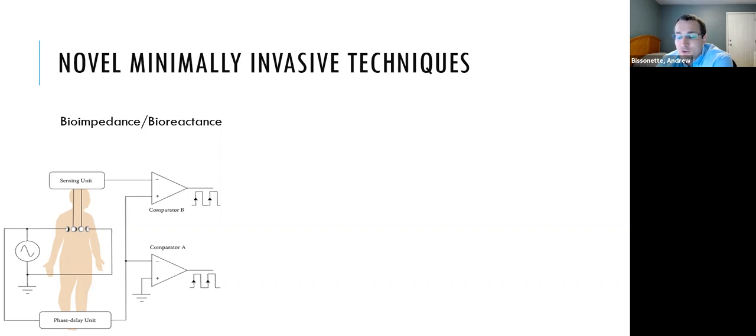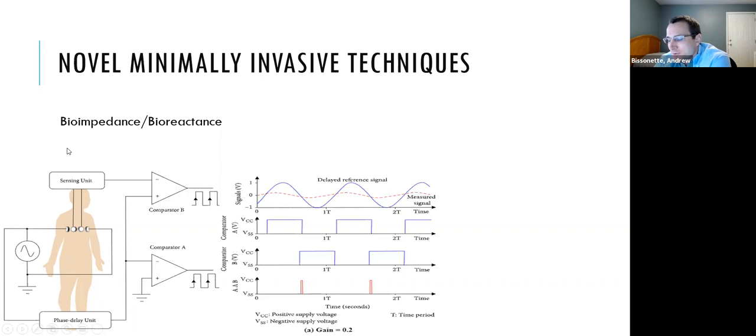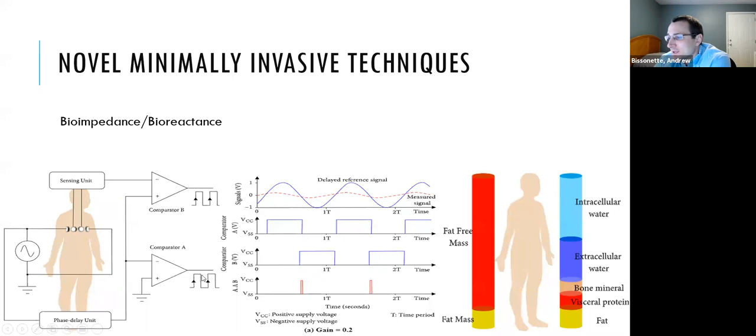I don't want to go much deeper into detail than that, but this is essentially what it ends up looking like. And the computer will do a lot of this for you, but you can basically break the patient down into different buckets of tissue and water. And what you're looking for essentially is the change in your extracellular water, which should theoretically be more or less the water inside of your vasculature. You're going to see how that changes in volume with each heartbeat that shoots blood through the aorta, and then is tracked via these changes in impedance.